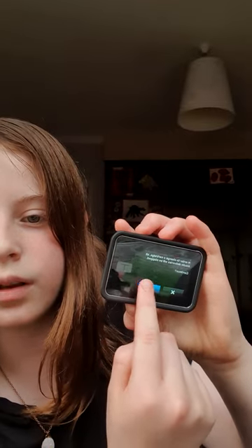Have you still kept this? Good, because you'll be needing it later. Now you go into your pump — so once you've logged in and gone into options, you'll go to Load and press Change Cartridge. Do that blue tick, make sure the set is disconnected from your body, there's another blue tick, and prep the list.